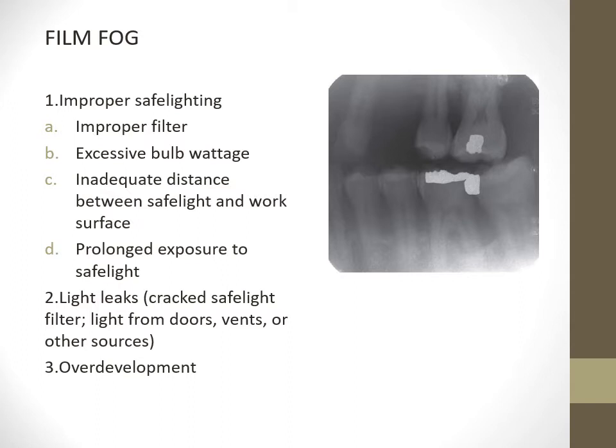And next is prolonged exposure to safe light. Don't expose the film for a long time, as it appears as film fog. Don't expose the film for a long time to the safe light. Just check it and get it back. Otherwise, the film fogs. Second is due to light leak.